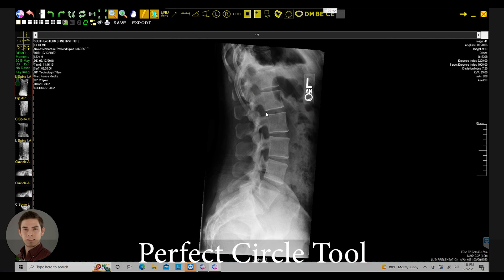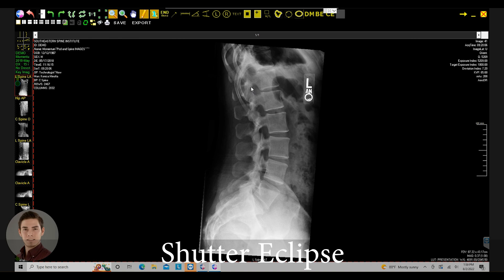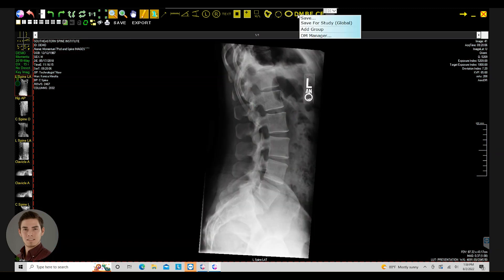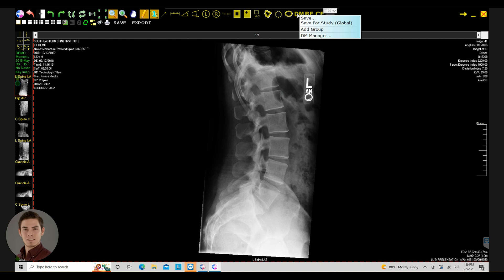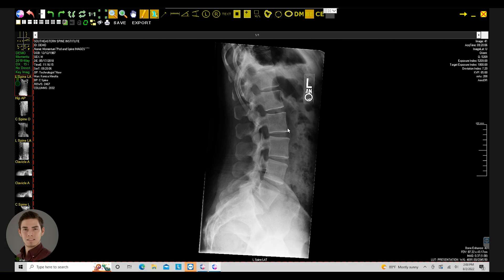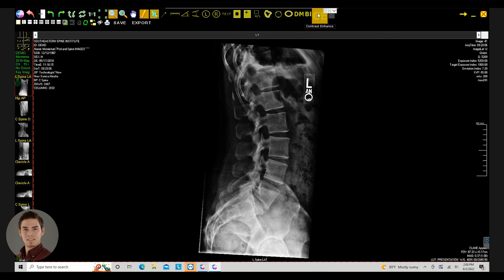The perfect circle tool uses three clicks. Then there's the shutter ellipse, which gives you an elliptical shutter. The display management tool saves the contrast and display settings for every image in the study, and you can also save it as an overall preset for all exposures. Bone enhance sharpens the image so you can see the ends of the bones better, and this can always be reset. Contrast enhance automatically enhances contrast, and you can deselect it if you'd like.